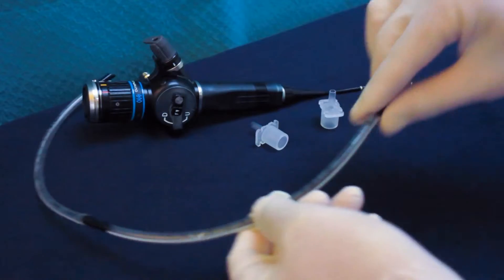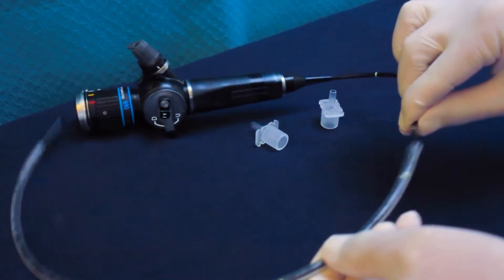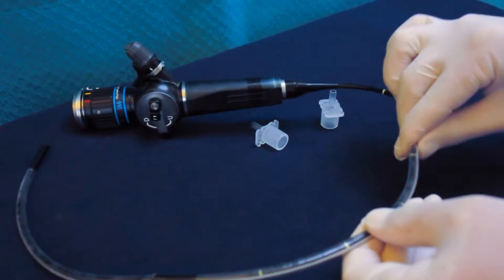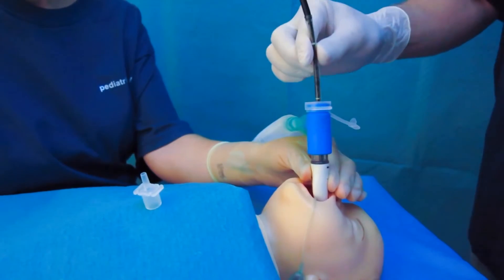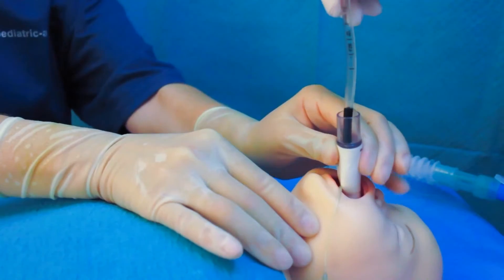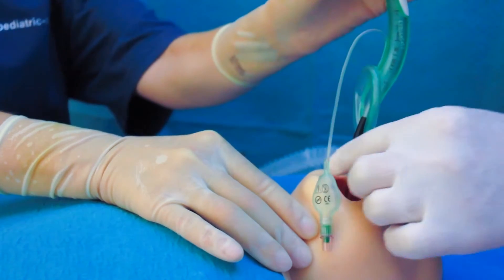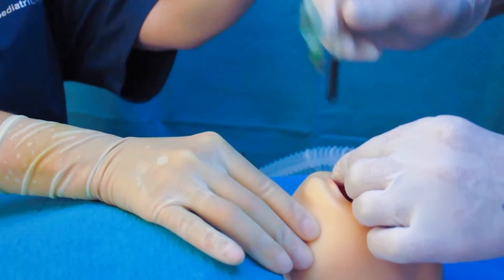How to do it? Stick two identical endotracheal tubes together and thread them on the fibroscope. After the distal end of the tube is pushed into the trachea, fix the proximal end and pull out the laryngeal mask. The proximal tube will stabilize the distal tube and prevent it from dislodging.